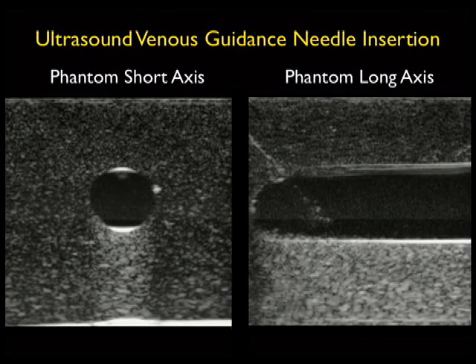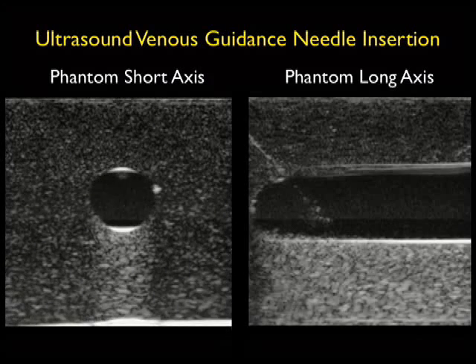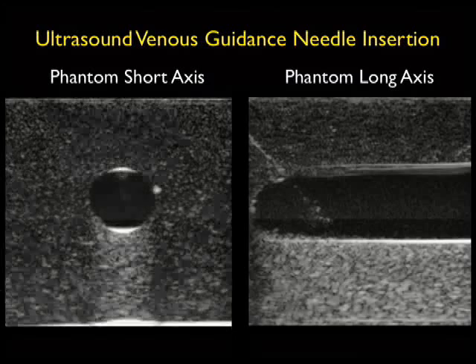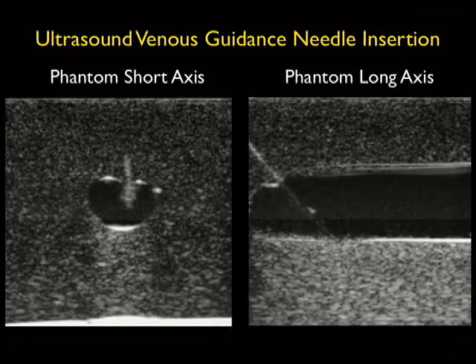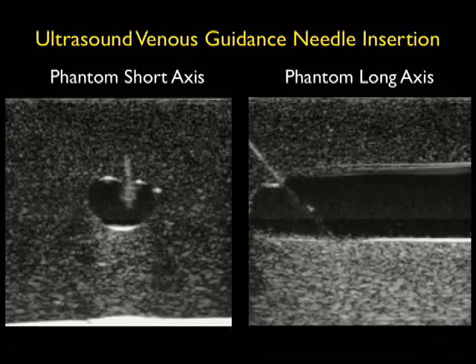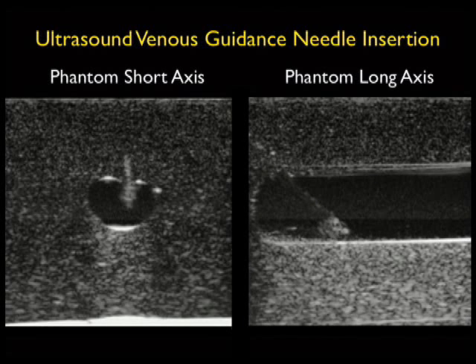Here's an example of what cannulation attempts on vessels using both short and long axis approaches look like using a phantom. To the left we see a cannulation attempt in short axis — notice the echogenic needle tip coming through, permeating the anterior wall of the vessel, and then the echogenic needle tip seen within the vessel lumen. This is probably the preferred starting approach, as most times we'll be able to enter the vessel using the short axis approach. Notice how good the long axis technique to the right is in terms of assuring the needle tip depth. Notice there that the needle tip goes through the back wall of the vessel — which is actually a common occurrence — and is pulled back into the vessel lumen, allowing you to then thread the angiocath successfully.